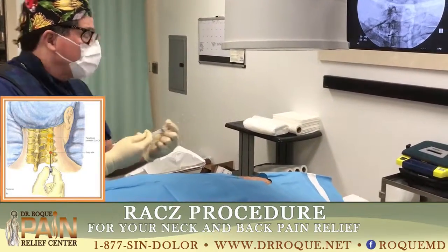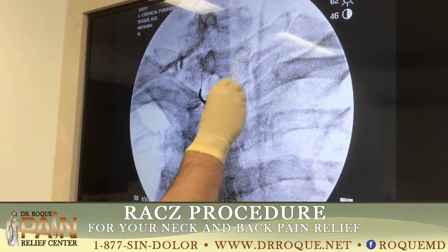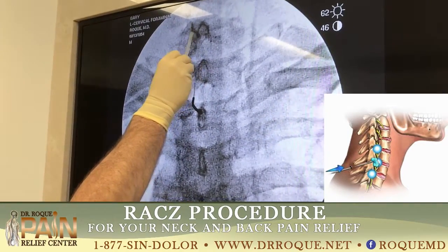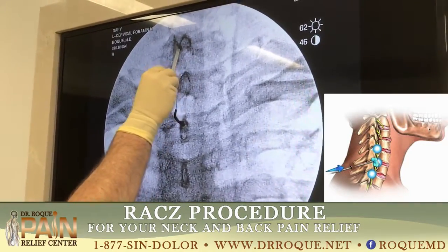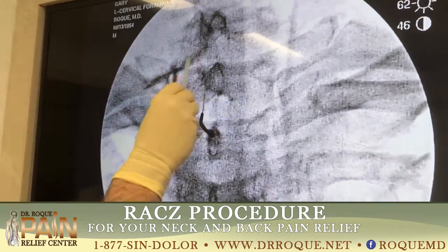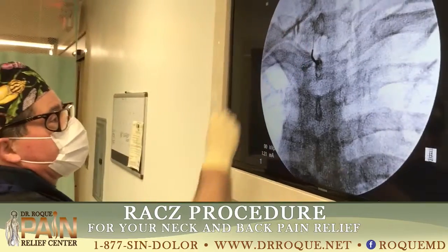I got some good news here. The first ribs were at T1. This is the C7 vertebral body, and you can actually see the nerve root coming down on the left side. It's very highlighted with the contrast used.